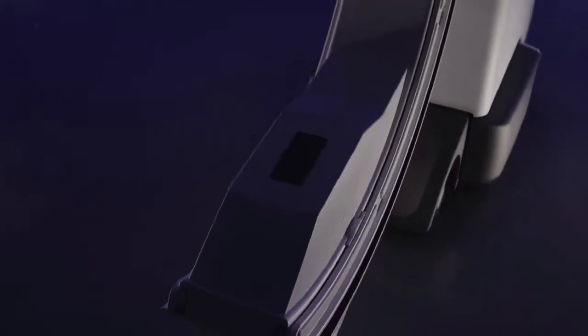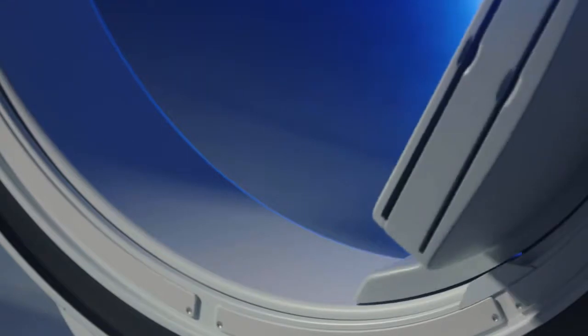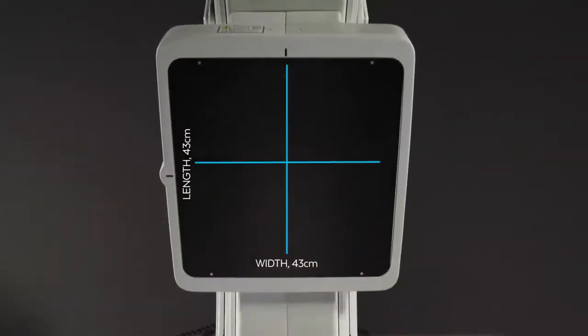Excelsius 3D's exclusive Broadview technology provides a maximized field of view in both 2D and 3D, approximately 50% larger than the leading competitor. The 43 by 43 centimeter detector panel is the largest flat panel for cone beam CT on the market.